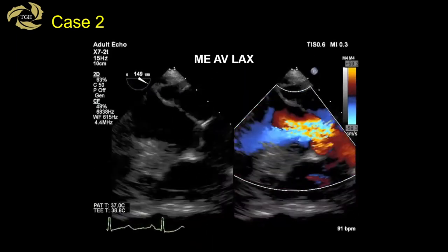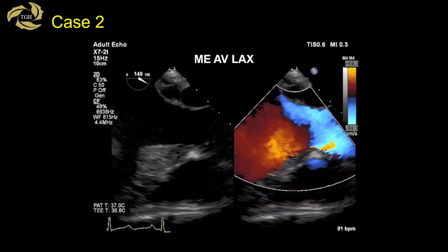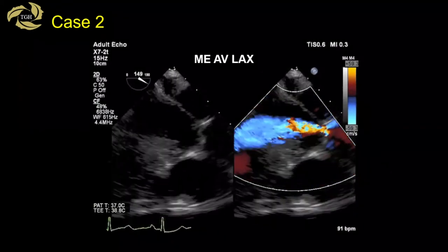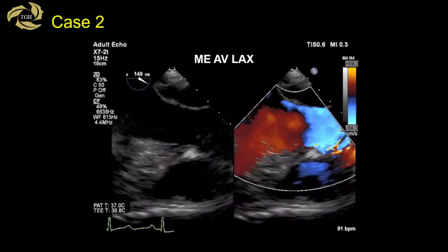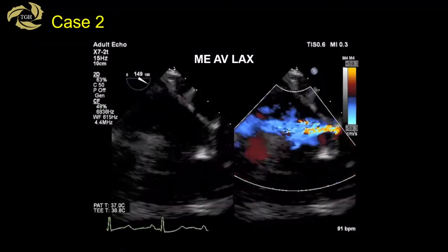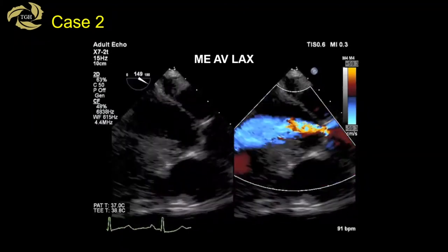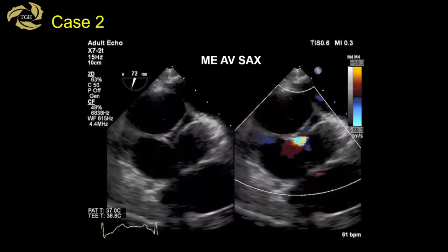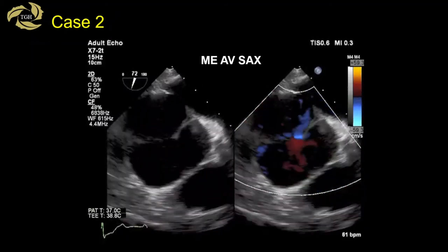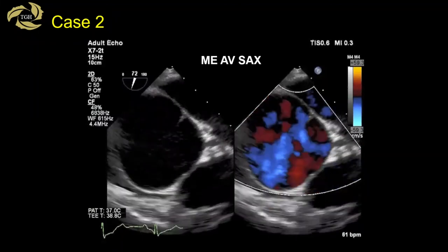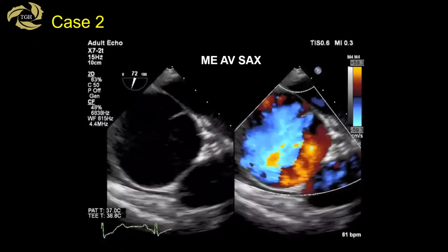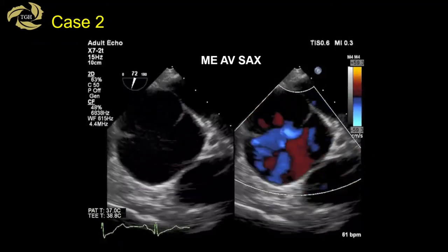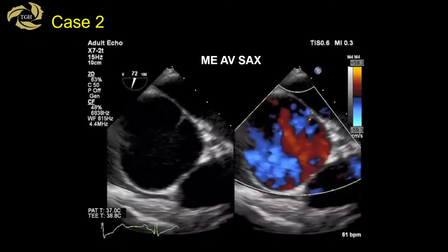With color Doppler, we see leakage — a central jet of AI. In a more zoomed view of the aortic valve and LVOT, central AI is confirmed. In the short axis view, the root is dilated — notice how large the aortic valve appears. Three cusps are present and seem to open well, but there is malcoaptation in the center, again producing a central jet of AI.